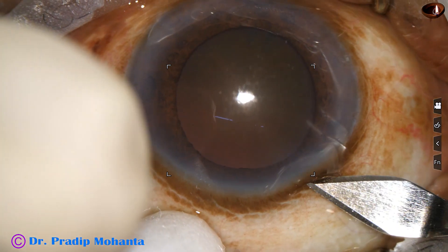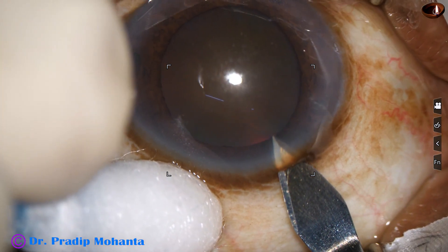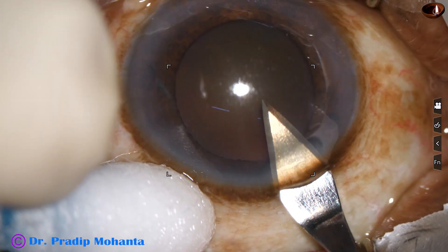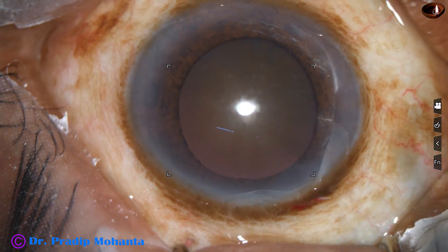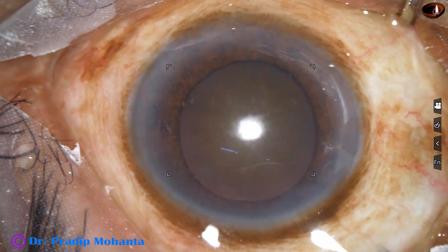This is the main incision with a 2.8 millimeter steel keratome. We have to be very careful while making this wound. The whole length of the wound should be at the limbus — no portion of the wound should go towards the cornea.